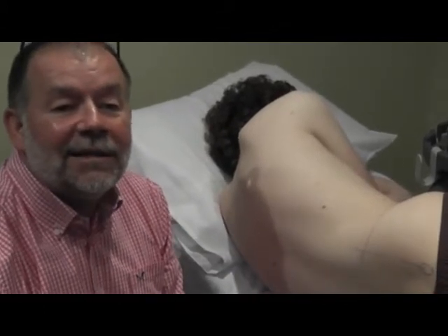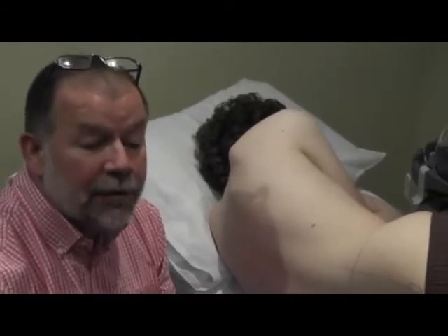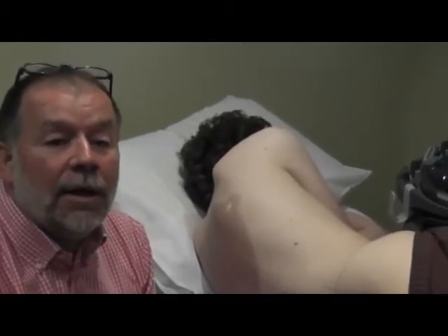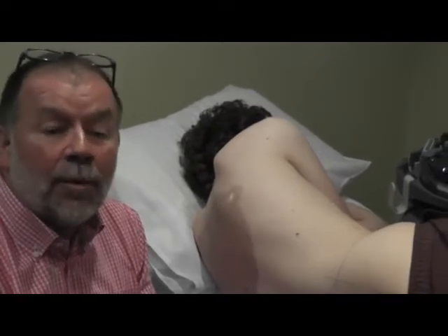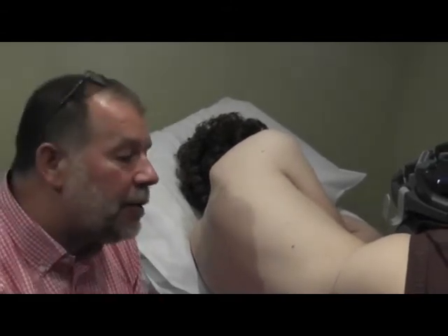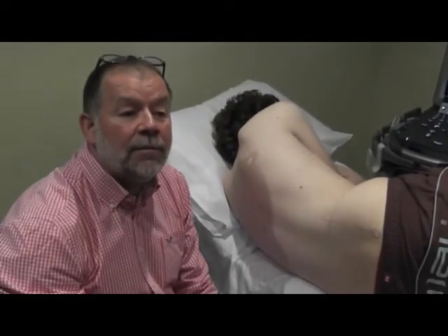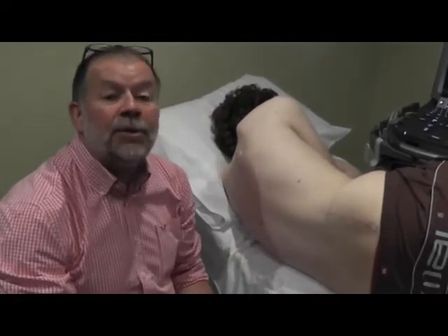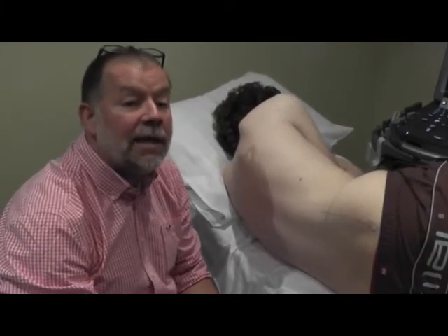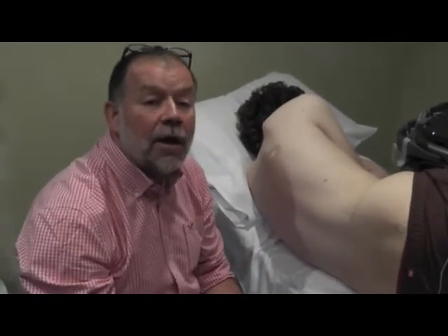You know, when you're going 10 centimetres, the amount of reflection you're getting reduces, therefore the clarity of what you're seeing is reduced, the frequency of the probe you have to use is lower, therefore the resolution is not as good. So the reason why lumbar plexus blocks have not found popularity with ultrasound is because of the depth and the resolution. But in certain people, where the distances aren't too great, and in young people, and so with children and young adults, then you probably have an opportunity to do that. In the elderly, you may well find that you'll struggle to actually see anything clear, although you can use ultrasound landmarks as a guide to where you want to do it.